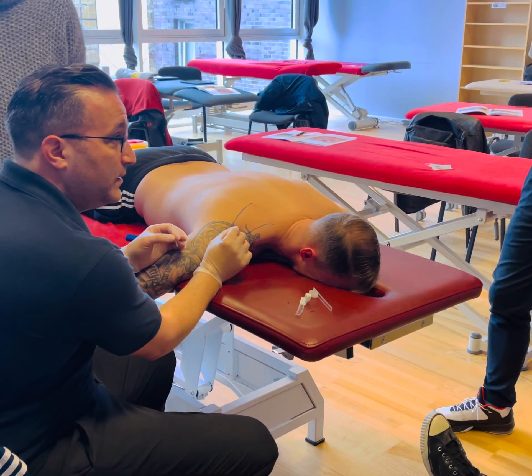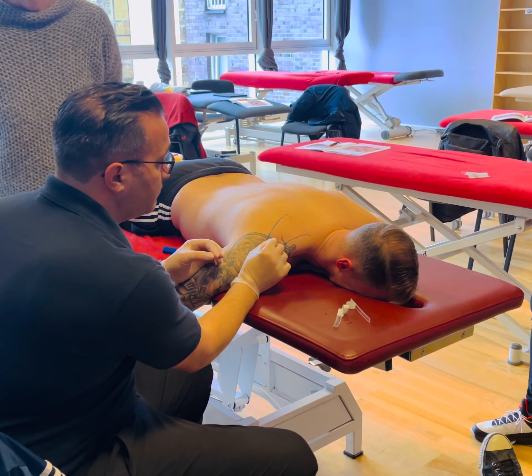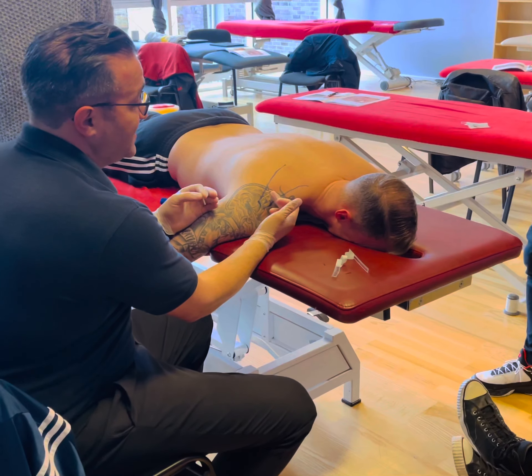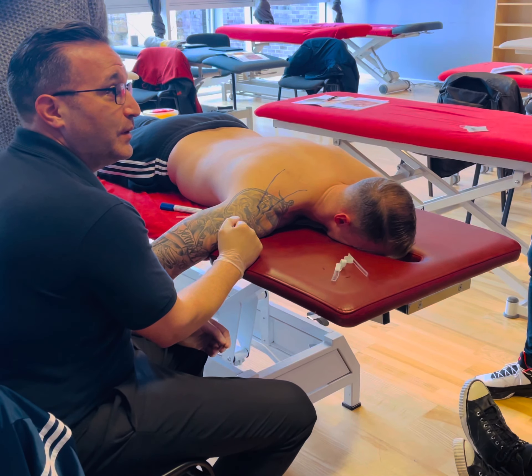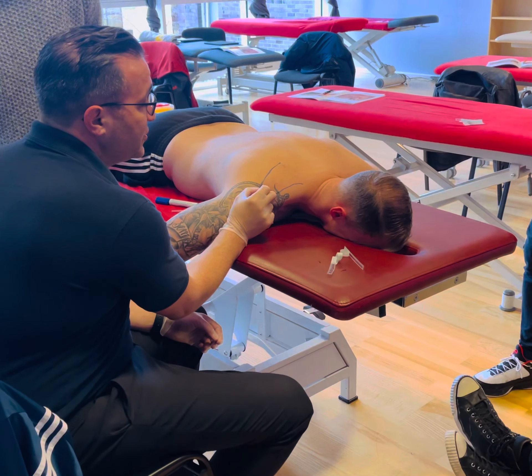Still haven't hit the fossa. Nothing? No, still haven't hit it. That is as definite as you can get beyond supraspinatus, okay? Unless he's developed a new muscle that we know about, okay? That is about as close as you're going to get.